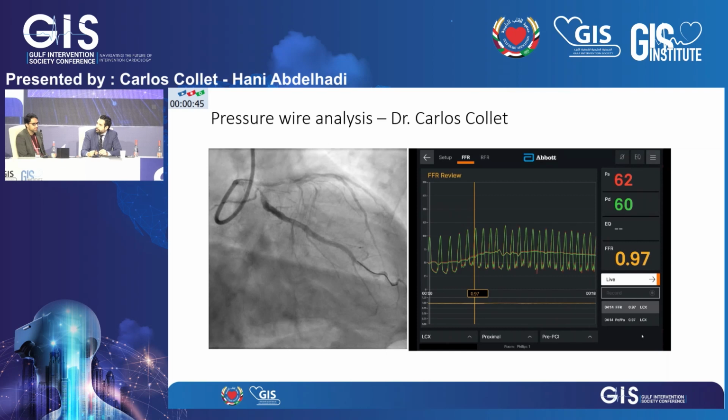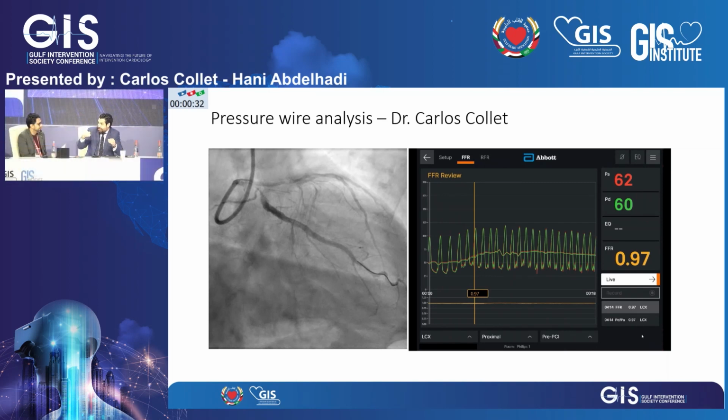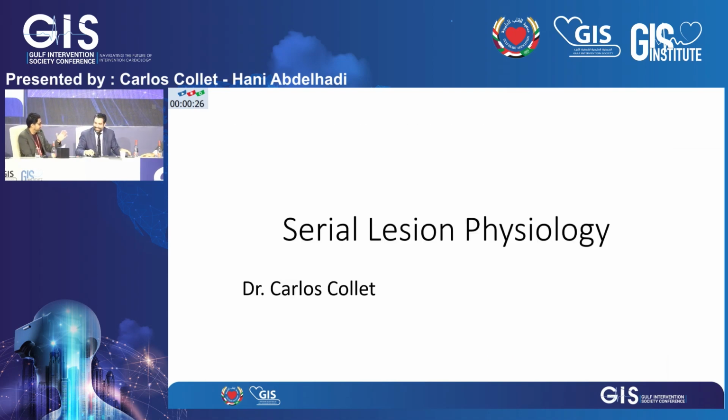So what do you do in your cath lab? Do you move your sensors up and down? Or what do you do when you're doing these cases? Well, I tell you what the Japanese did. They put the wire in the LAD and asked the patient to sit up, and the FFR changed about 5 units. Somebody in London published that as well. They turned them upside down. You know that? Literally, to prove the hydrostatic effect.